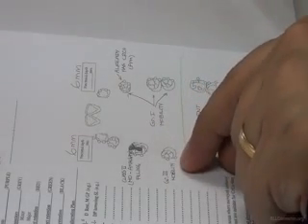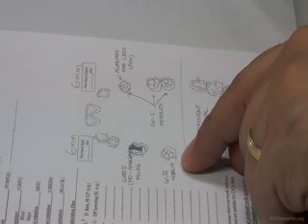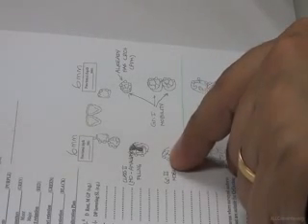Once again, the case as it is, is class 3 mod 5, right? As it is. Then the first condition I put is that the molar has grade 3 mobility. That means plan for extraction. That means I have a saddle area now here. It became class 2 mod 5.